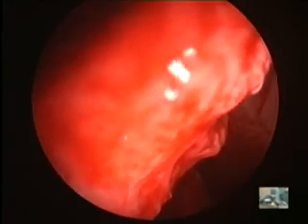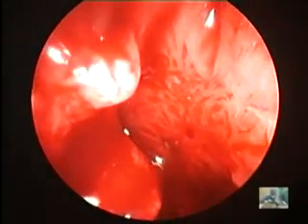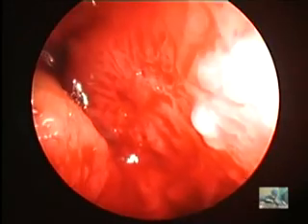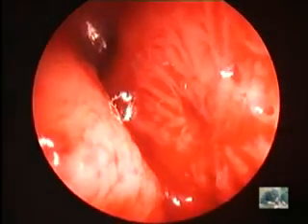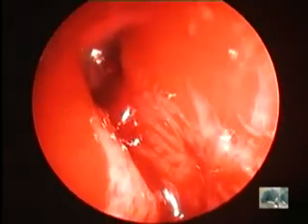Probably not. It's the piece of bone I introduced into the sinus during the inferior meatal antrostomy. Oh, okay. Now I can see a bigger opening through here now. Can you slide that sucker into that maxillary sinus? Right angle sucker. See if I can get a clearer picture.